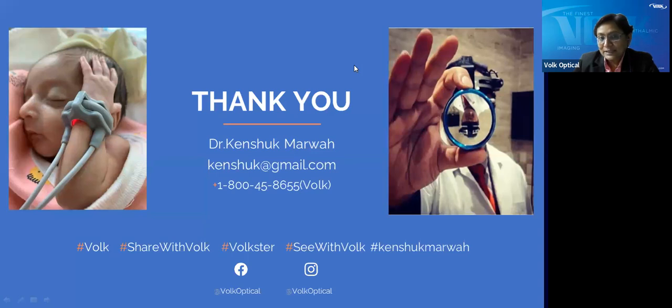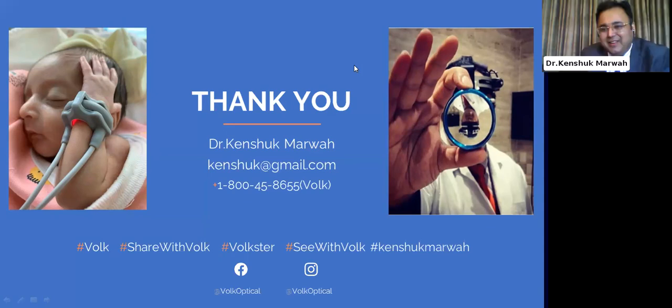Okay, so I think the next question is pretty much in line with this again. This doctor has been using a 90D for the last 3 to 4 years. So the doctor would like to understand what they will achieve if they start using a 78D now? What they will achieve is a much better clinical analysis, because like we have also mentioned in the slide, as you get more magnification, the field of view decreases. So you're not actually looking at more of what you want to look at.